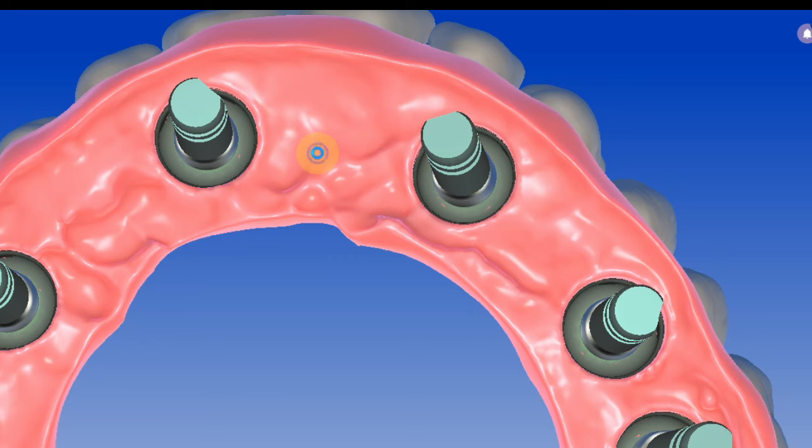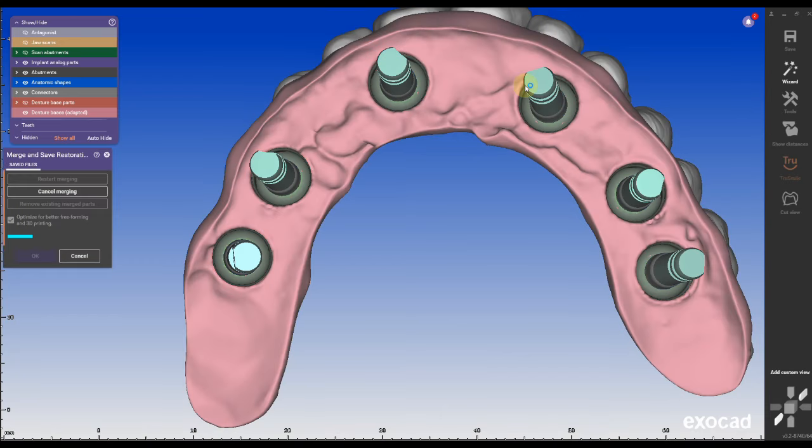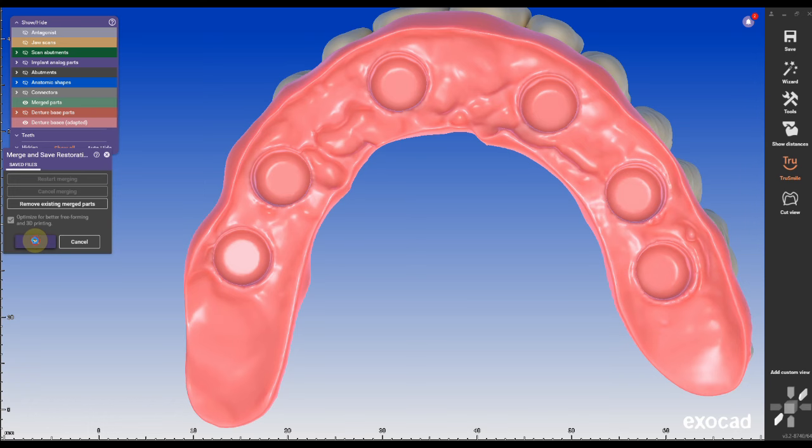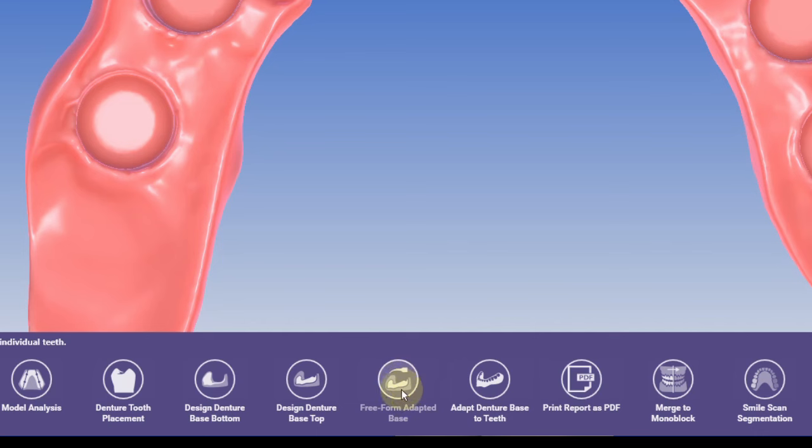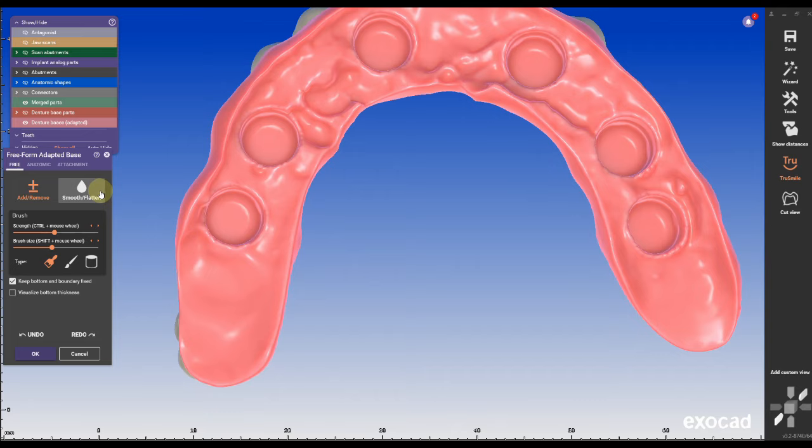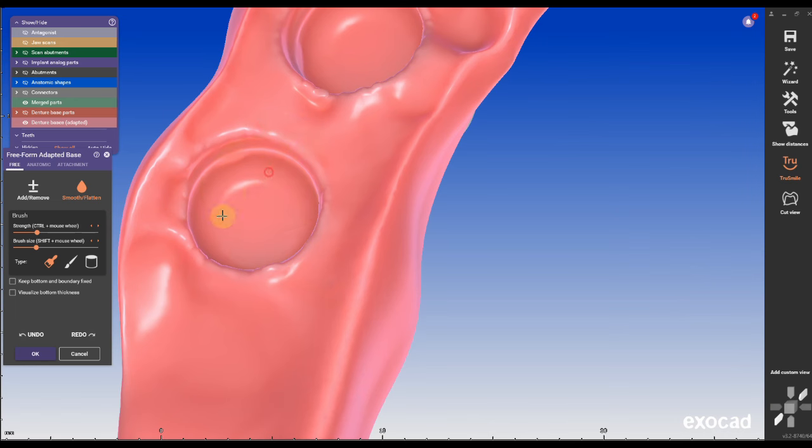To smooth out the basal surface we must switch to expert mode, right click on the tissue part and choose merge from the menu. On the bottom menu in the expert mode we can select freeform adapt base and uncheck keep bottom and boundary fixed.